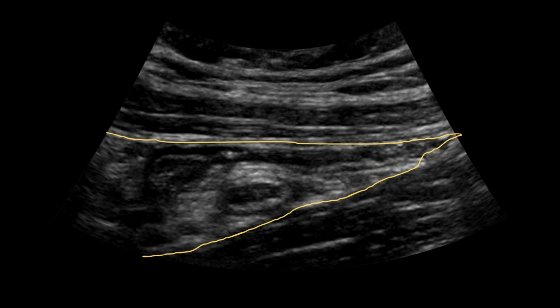This area often contains distractors. The cecum is usually just above or to the side of the appendix. It often contains gas, which causes dirty shadowing. You must use graded compression to push this gas away. The terminal ileum is also nearby. Unlike the appendix, it shows peristalsis and is open at both ends. The appendix appears as a round target sign in this space.